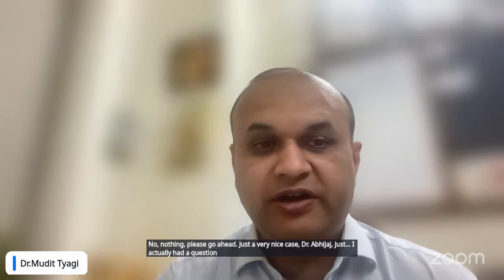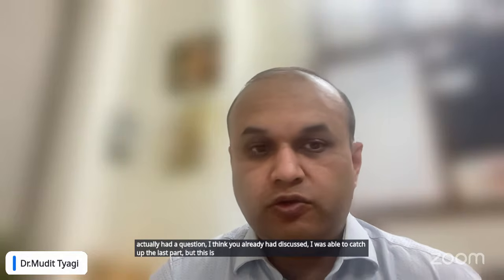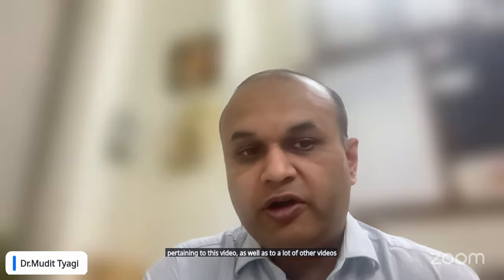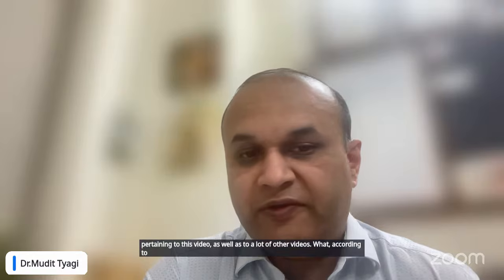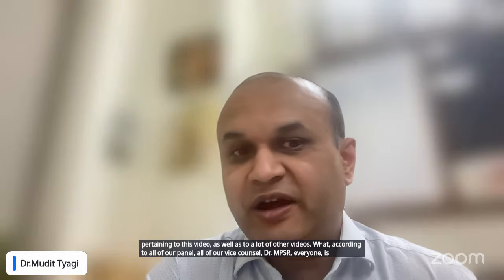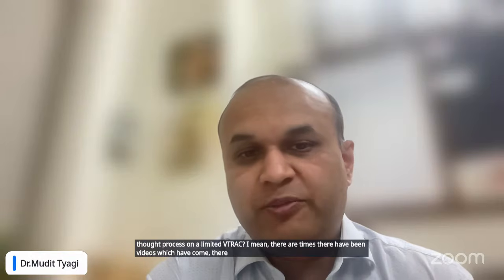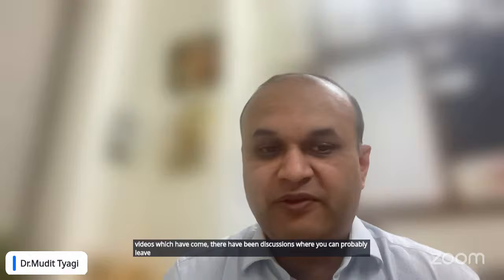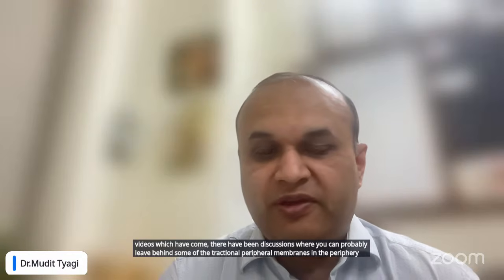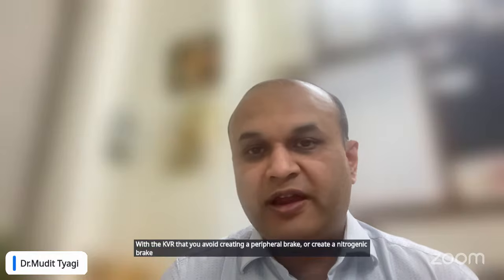I actually had a question. I think you already had discussed. I was able to catch the last part, but this is pertaining to this video as well as to a lot of other videos. What, according to all of our panel, all of our vice council, Dr. MPS, or everyone, is their thought process on a limited vitrectomy? I mean, there are times, there have been videos which have come, there have been discussions where you can probably leave behind some of the tractional peripheral membranes in the periphery, with the caveat that you avoid creating a peripheral break or an iatrogenic break. So what is your threshold of a trade-off?